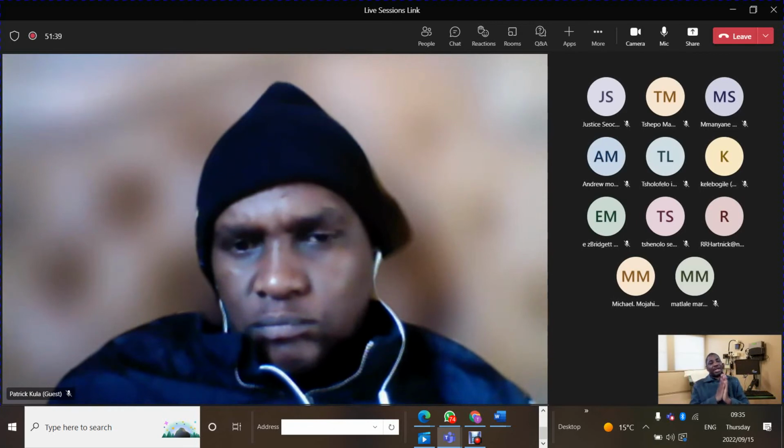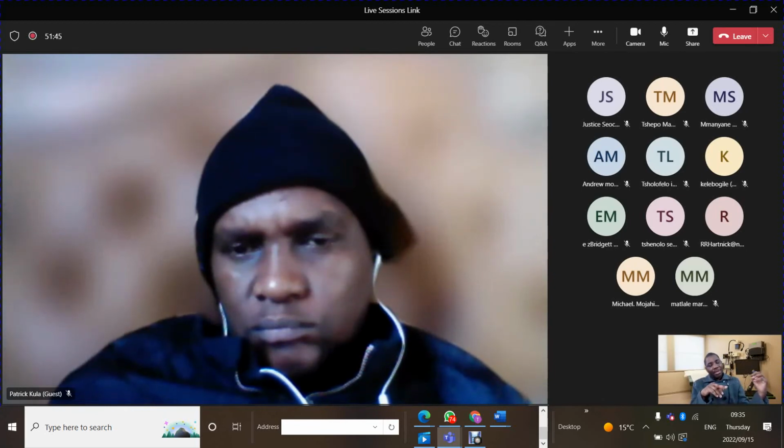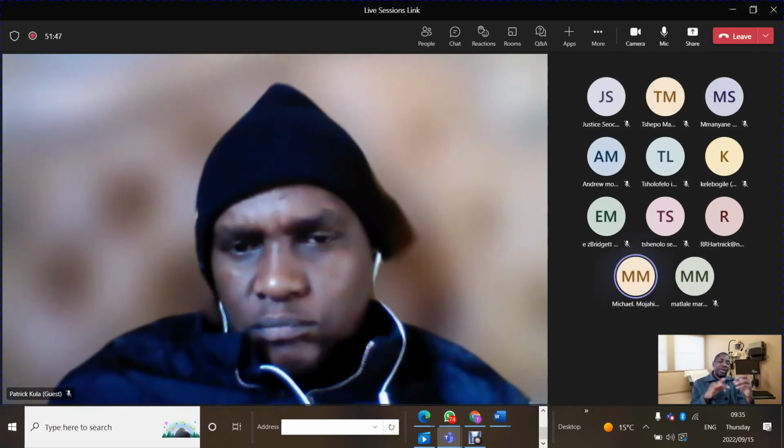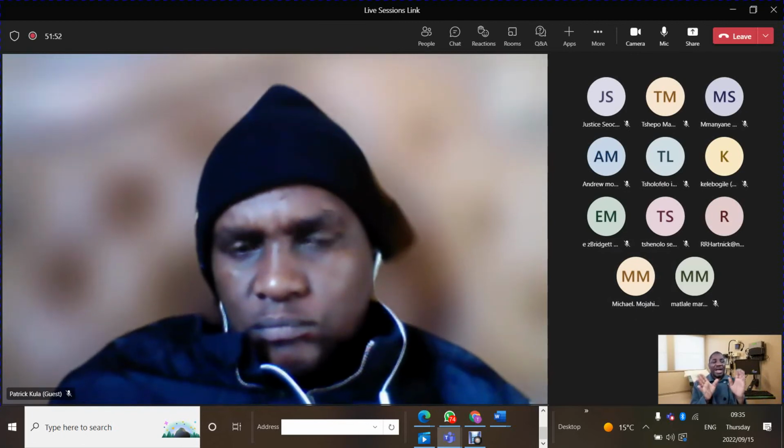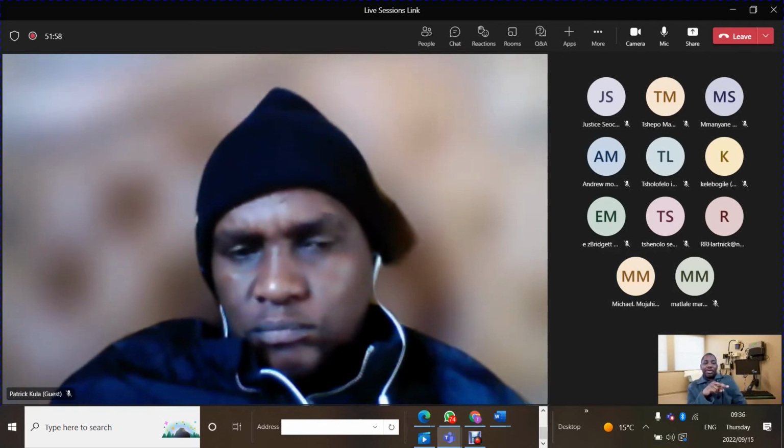So these are some other things that can cause incorrect readings for SpO2. When you're putting that finger probe into a finger, make sure that it's a finger that does not have too much artifacts, so that your readings can be correct. Because if you're not picking up correct input signals, your output will not be right.